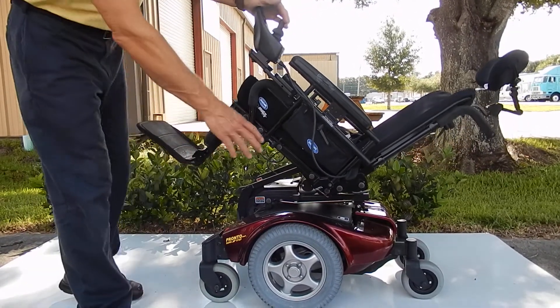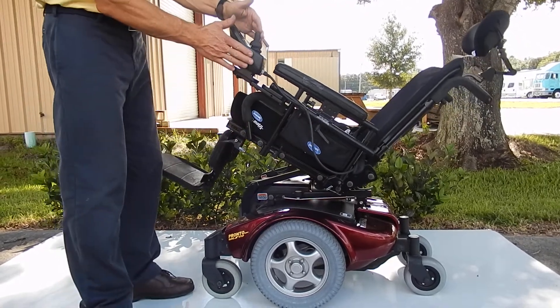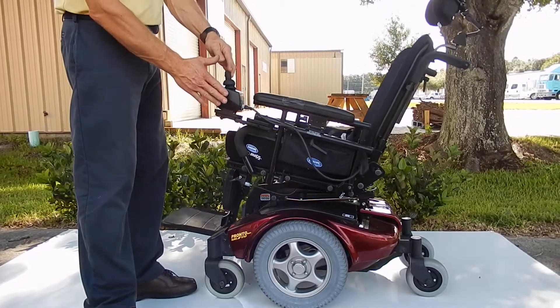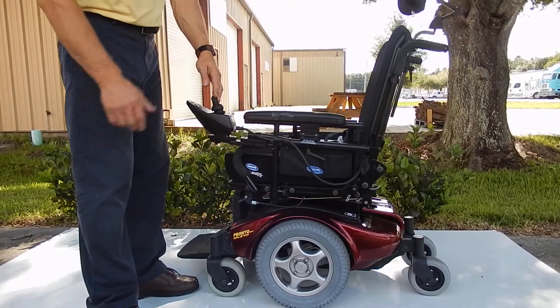This chair has solid tires all the way around. The joystick can be put on the right or the left. Right now it's on the left side, but we can switch this to the right side with no problem at all.